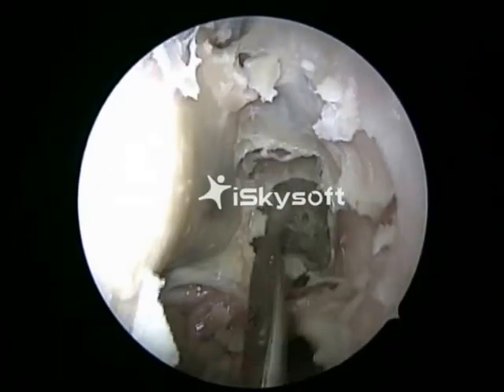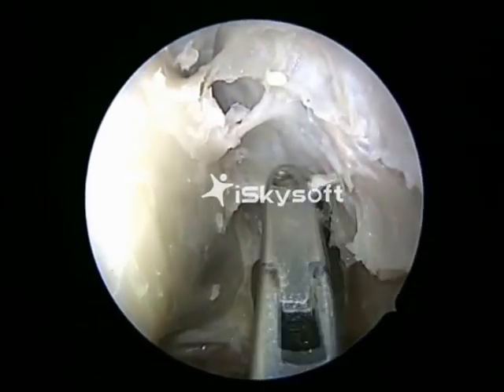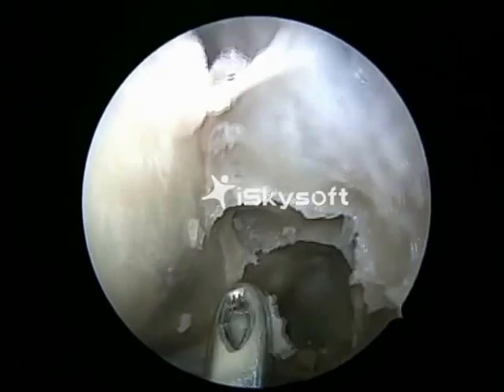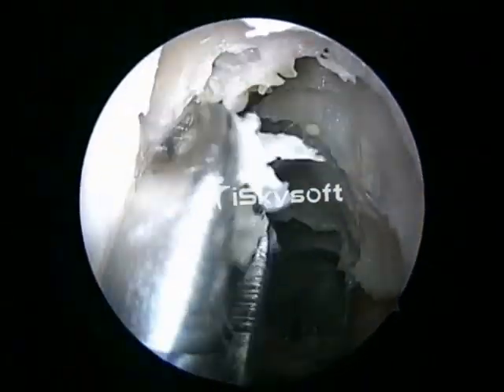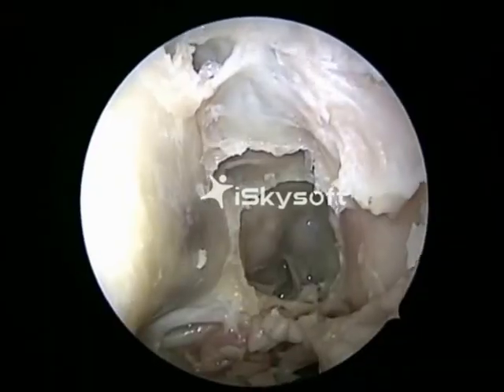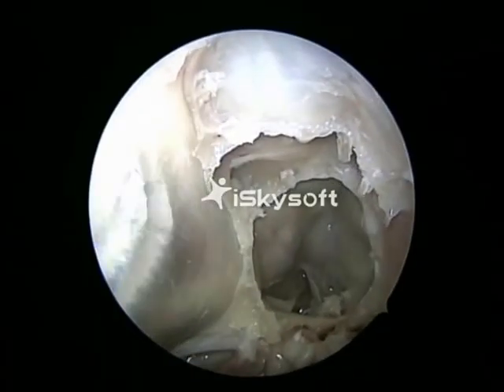That's the orbital periosteum. It's advisable not to remove or incise the orbital periosteum till we do the optic nerve decompression, because the fat prolapse will obscure the view of the optic canal. Once we decide to do an optic nerve decompression, it is better to remove the bone medial to the optic nerve and then incise the orbital periosteum. That is the medial rectus muscle.